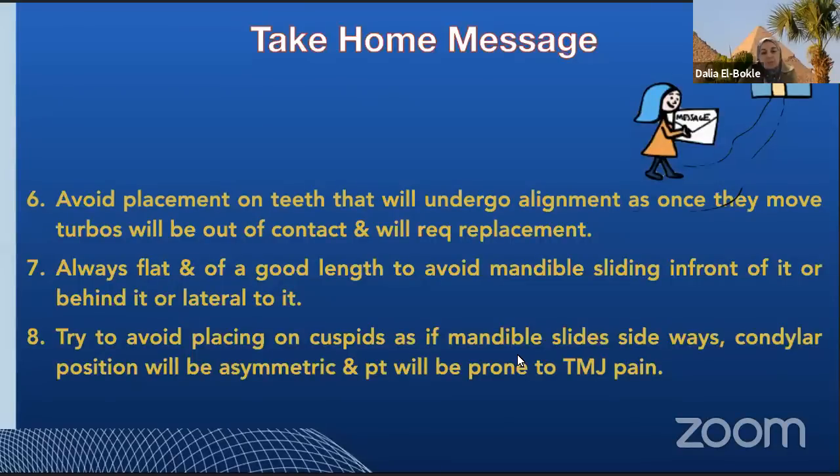And try to consider the condylar position. So they have to be always symmetric. Otherwise, the patient may become prone to TMJ problems.